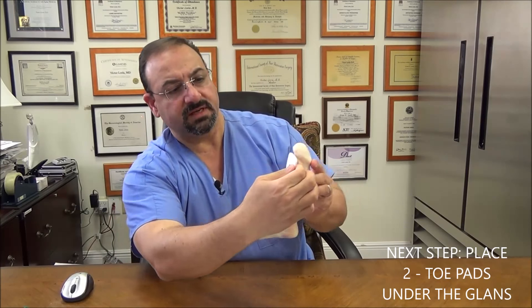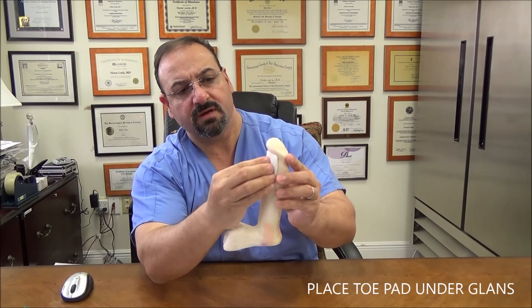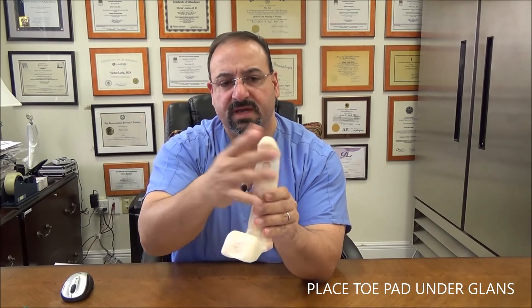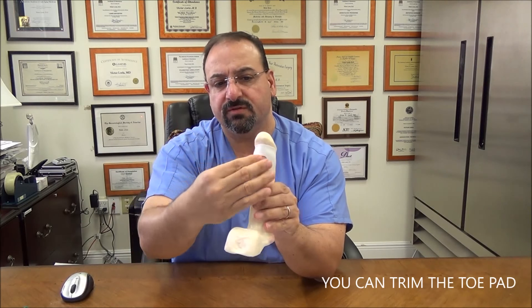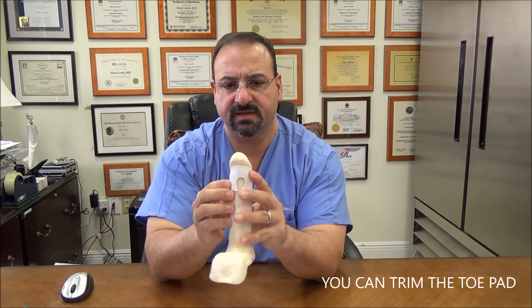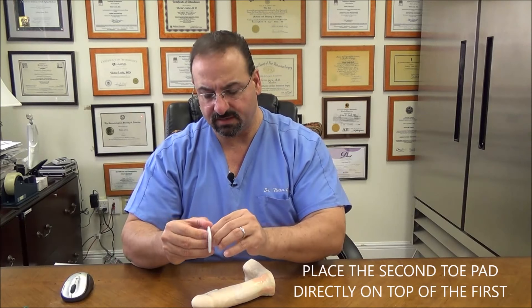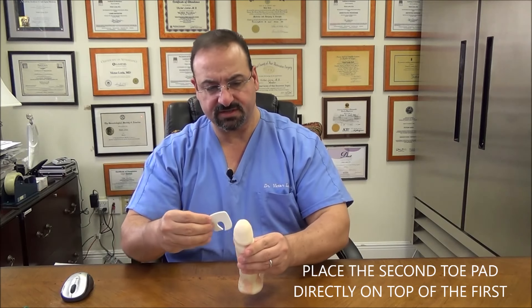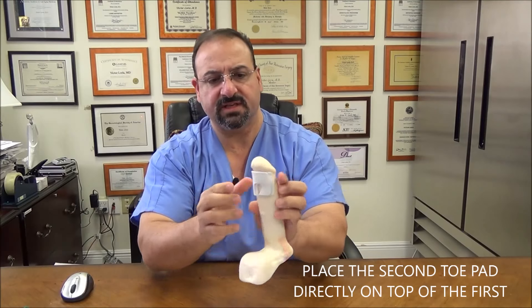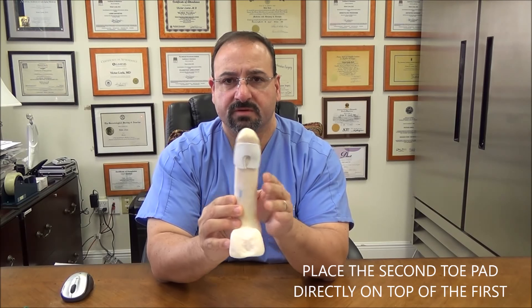You go under the glans — just under — and kind of form and shape it right there. If this is too big you can always trim a little bit with a scissor; you can cut these legs off if it's too big. Otherwise it usually fits on most patients. We're going to put another one on top — center it the best you can and put that underneath just like that. It usually sticks pretty well. So there's your toe pad — that's the second step.